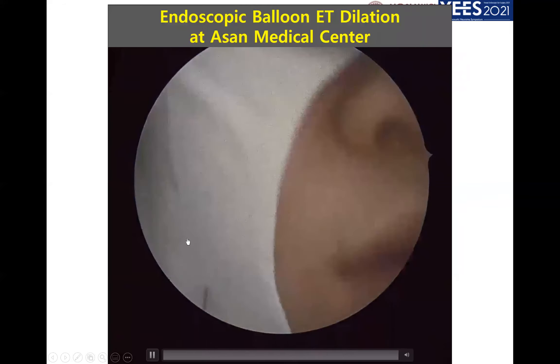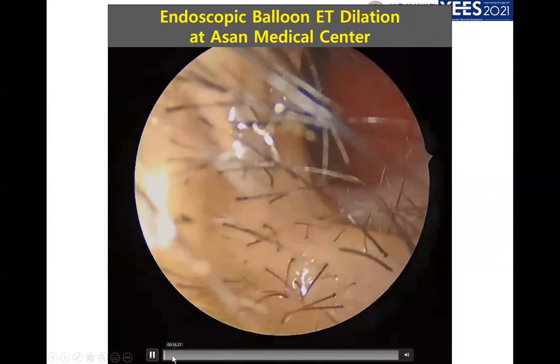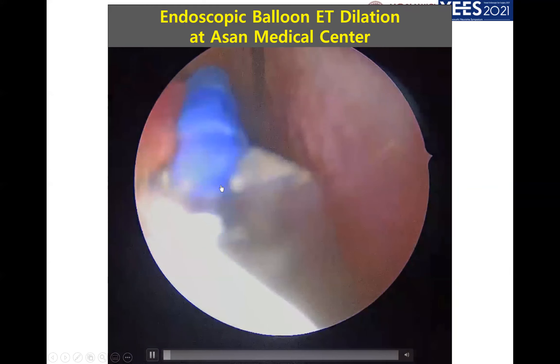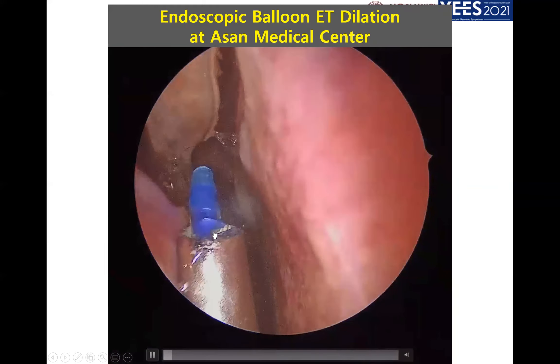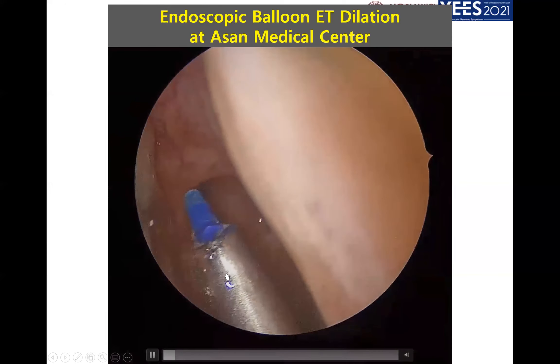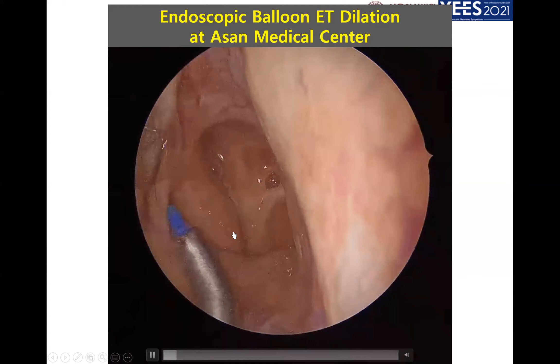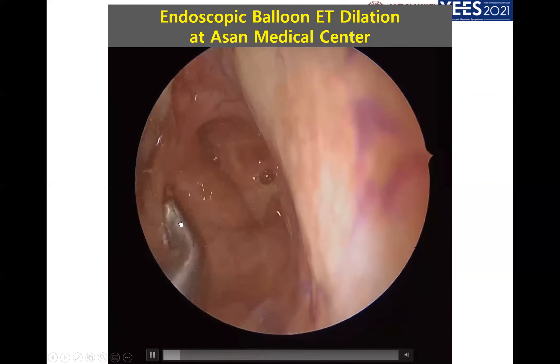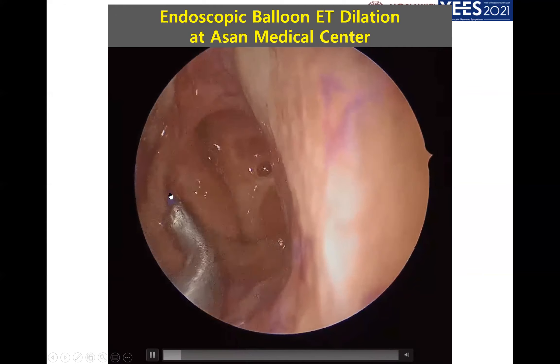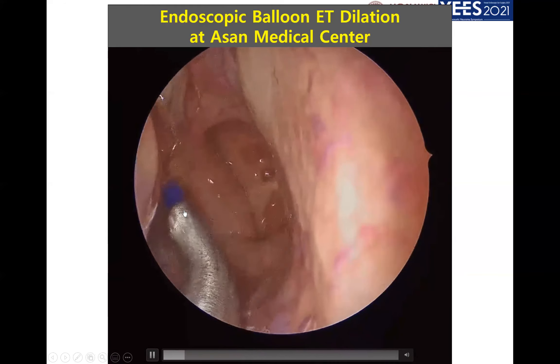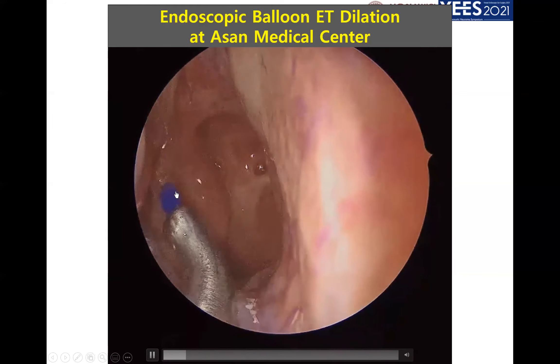I'll now show some video clips of endoscopic balloon dilation. I generally perform this under local anesthesia, and I place the tip in front of my endoscope so I can see where the balloon is going. We can easily find the eustachian tube orifice and then insert the catheter into the eustachian tube. You can see the marker here, which indicates that 20 millimeters of length has been inserted.